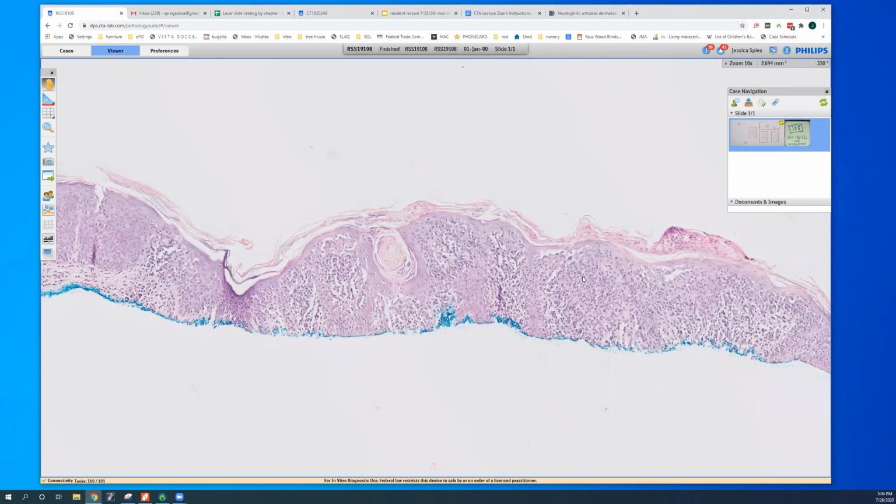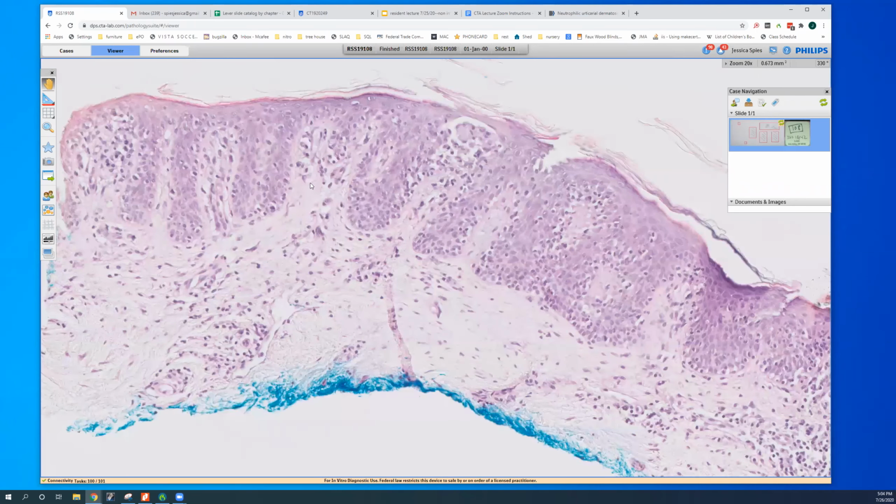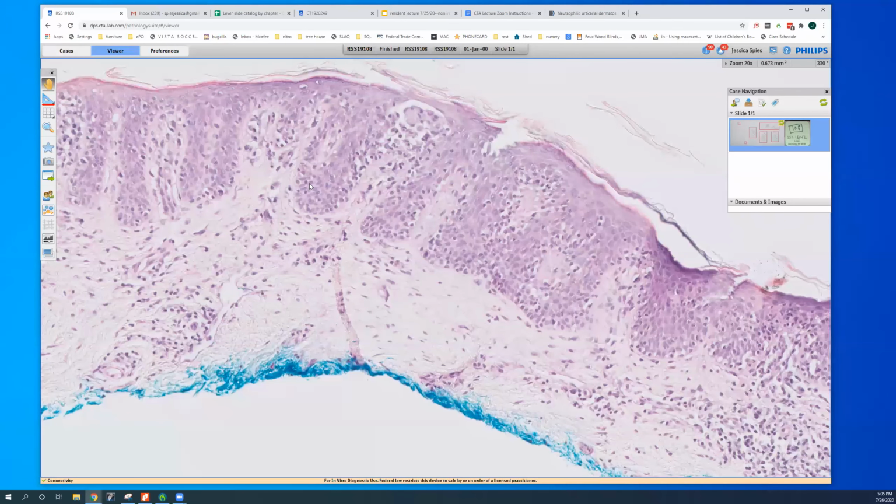And you might eventually get this if you follow a patient over many months or years. It might start out as non-specific histology, a little bit of spongiosis, a little bit of dark lymphocytes, but not so great. And I have had cases where patients have been biopsied over several years, and they eventually develop this classic patch stage histology appearance. So, yeah. Better to underdiagnose mycosis fungoides in the patch stage than to overdiagnose it.